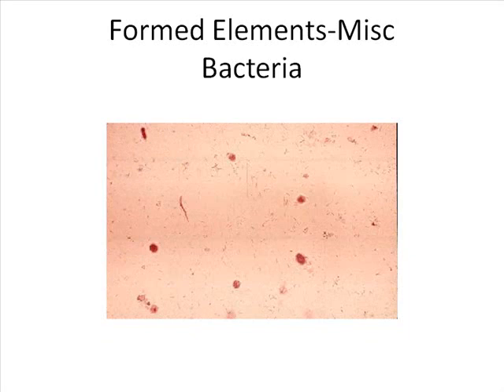All right, now bacteria, this is a little hard to see, but bacteria, remember, most commonly is rods, but you can also see cocci. Very difficult to tell on just a particular slide like this or a wet prep.